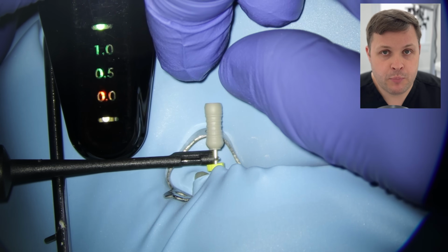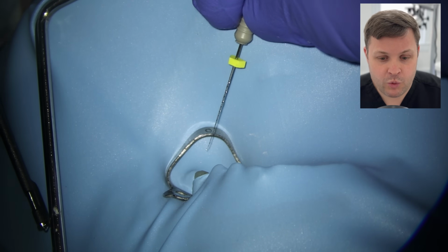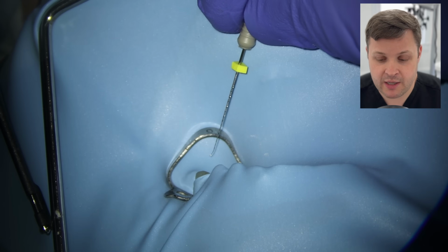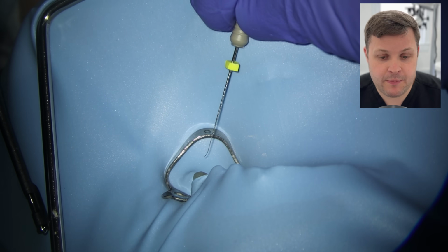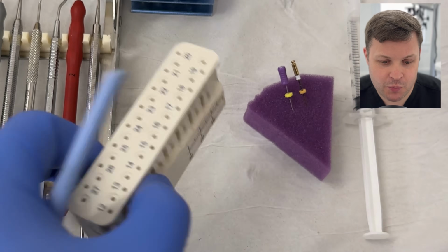So we're just going to push the hand file out and then back it up. We're going to notice where this bend is. So this bend is moving towards the buccal. So again, another thing that I'm thinking: do these two canals join? So again, always keep your wits about you. You just want to think about every eventuality so you don't make any mistakes.